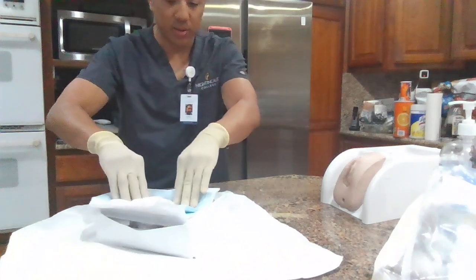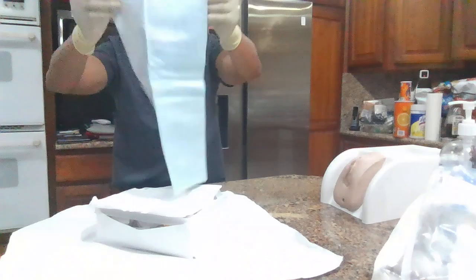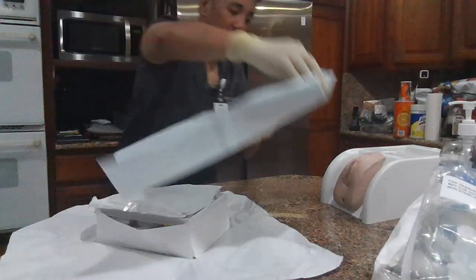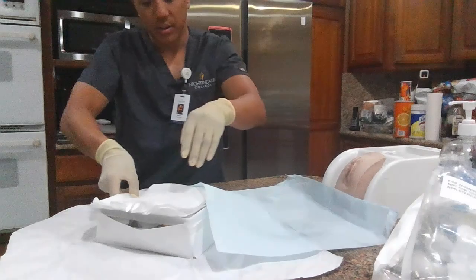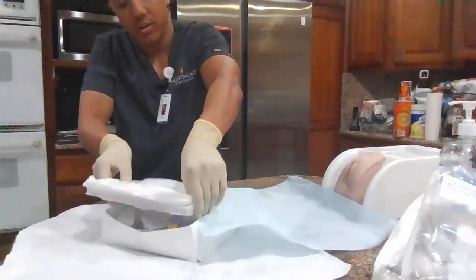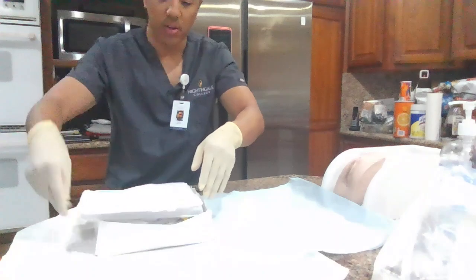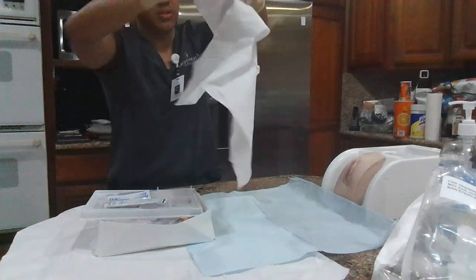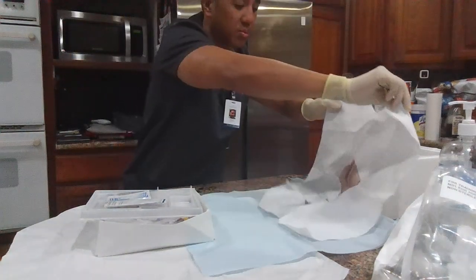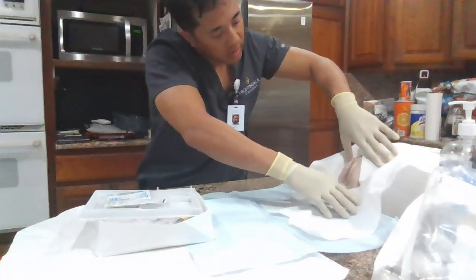All right, Mrs. Smith, if you can carefully lift up your hips, I'm going to first put the first drape under her hips like this. Thank you very much. And I am now going to carefully take the other drape and place it over her area like this, to expose the fenestrated hole through the drape like that.